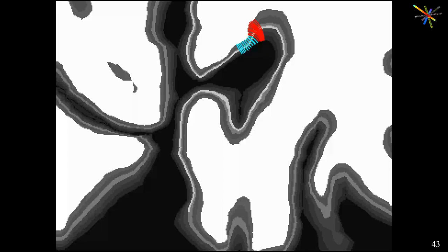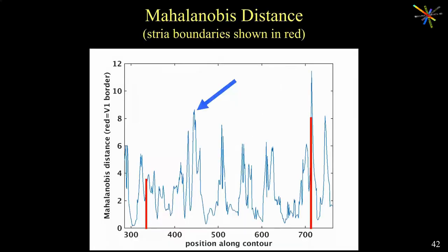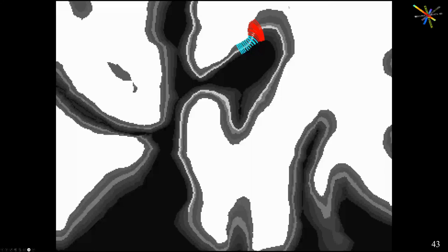That oblique component makes the streamline features that I extract from the data look very different in this block than this block. It looks like a change in cortical architecture. I mean, you could see it on the slide. This stuff looks like a different cortical architecture than this stuff. It's not. It's because of unaccounted for through-plane folding.